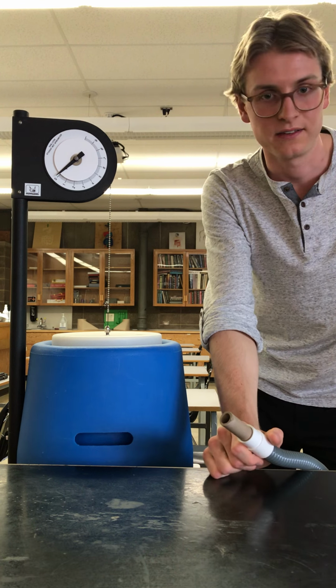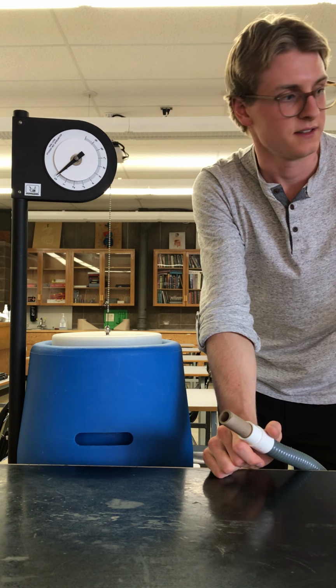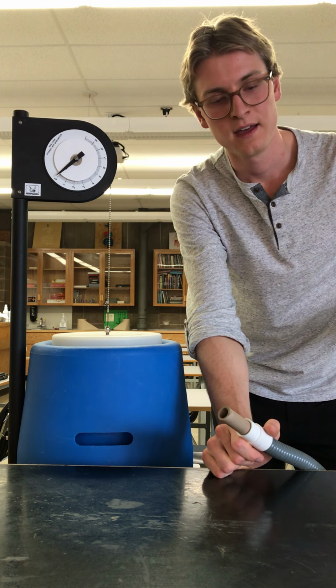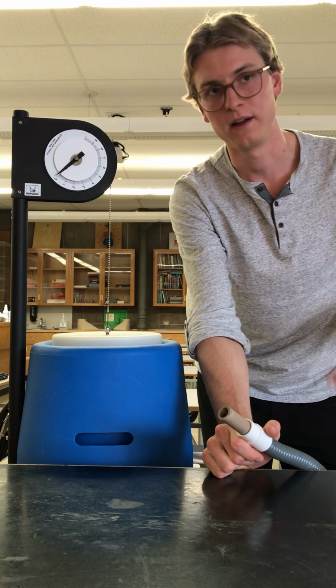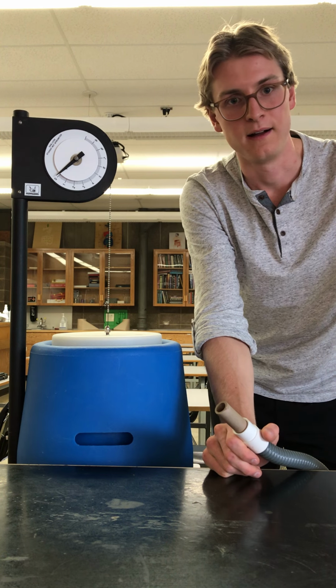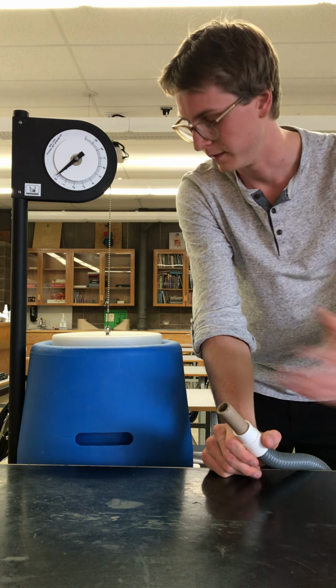Awesome, so the next one I'll test will be the expiratory reserve volume. That is after a normal breath, inhale, exhale, then you continue to exhale in one straight motion all the rest of the air you can. That's the whole expiratory reserve that's held in your lungs, and we'll be able to test that here.